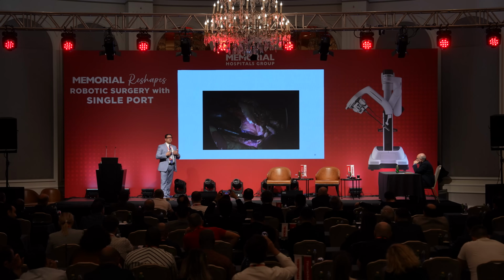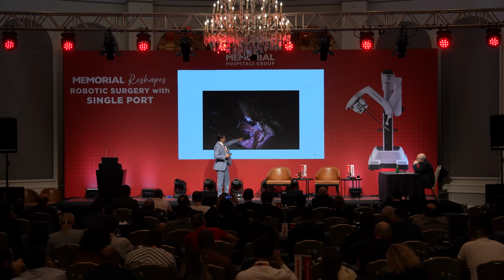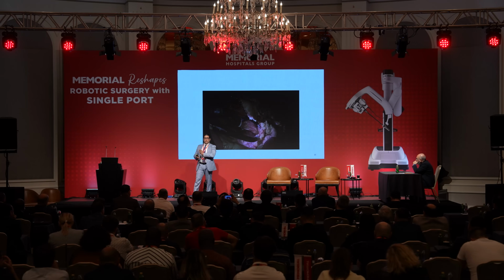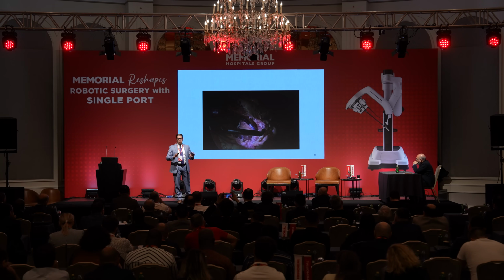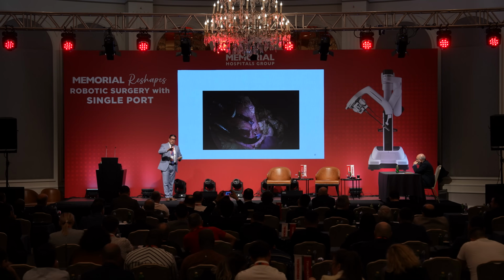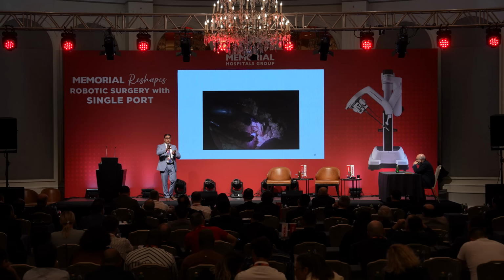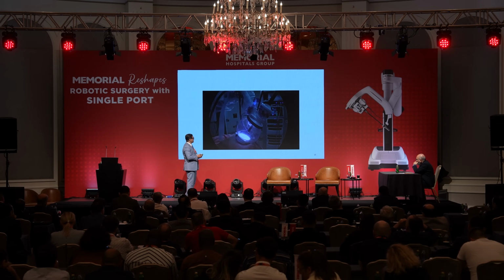The reason I don't take the ileocolic vessel early is that if you take the ileocolic vessel here, that part of the mesentery is so fragile that you're going to cut through the mesentery, and in my mind, you will have an incomplete mesocolic resection. Therefore, I like to keep the vessel, and I like to drop down the D2, D3, and even separate the adjacent portion of the head of the pancreas. And now I know that I have a good mesocolon, that I can do a good oncologic resection.